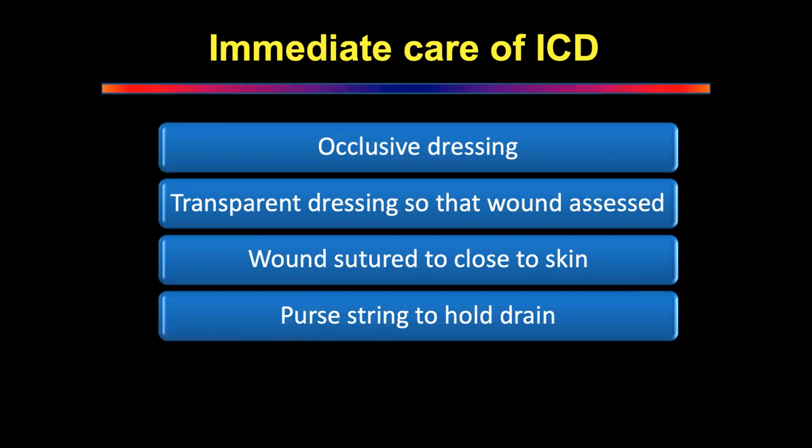Okay? If you have put in 2 drains, what are the precautions? Situn, you are a pediatric cardiac surgeon. Tell me. You have put in 2 drains. What is the precaution you have to take for 2 drains?